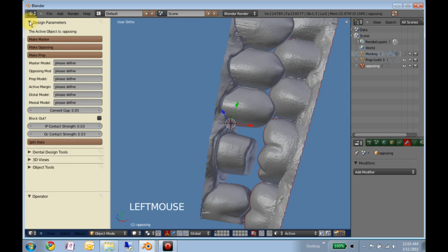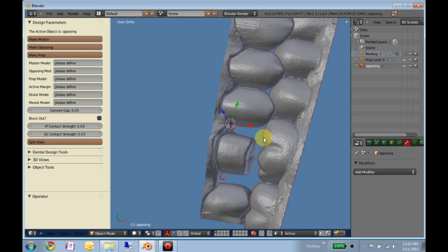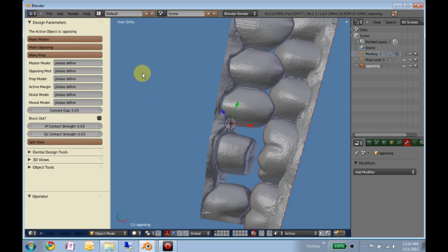The first thing we'll do is drop down the design parameters, we'll select one of the models by right-clicking, and we notice that it's highlighted in red, and this is the opposing model, so we'll make that the opposing.